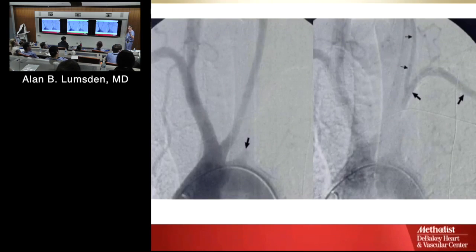So the takeaway is there are flush catheters for opacifying big blood vessels with high flow, and there are diagnostic catheters. What you saw earlier, when we put that thing up in the vertebral, that's a diagnostic catheter, an end hole catheter. You inject in the vertebral, you don't do 20 for 20 at 900. You'll back it down and do something like 5 for 10 at 500. These are things you'll just learn.